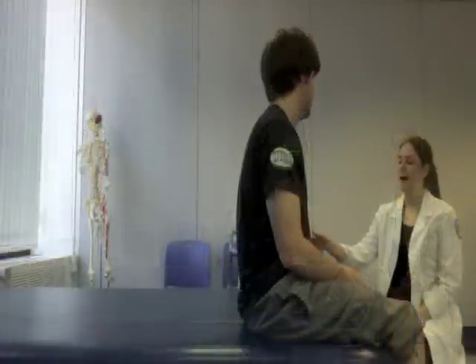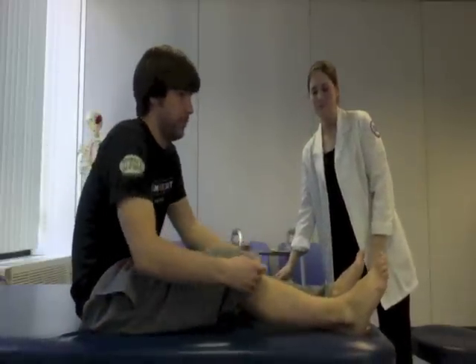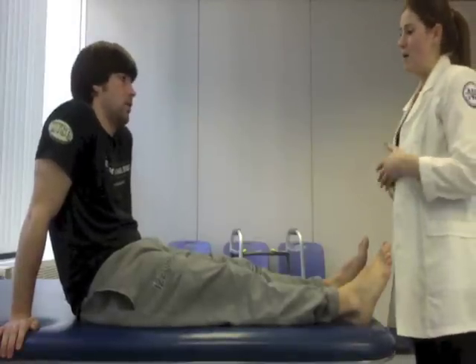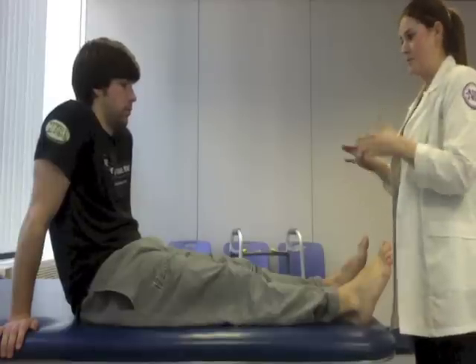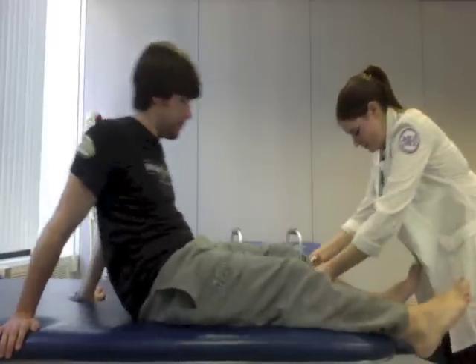Okay, so you can go ahead and lie back. For this measurement, all I'm doing is taking a tape measure and I'm going to wrap it around your ankle really gently. If you feel uncomfortable at any point in time, you can just let me know and I'll stop. I'm going to do your left side first to get a baseline measurement.